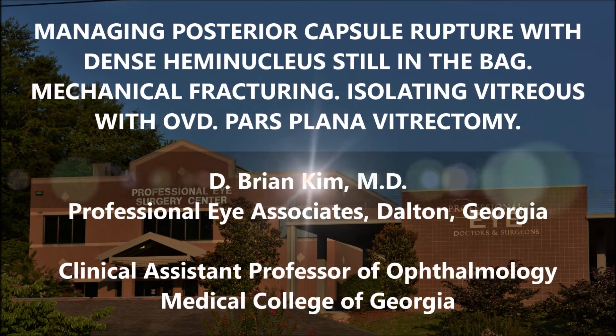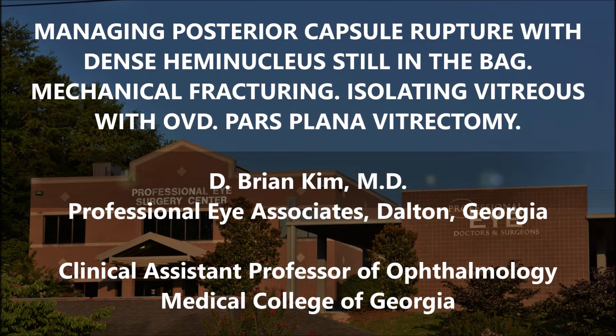This is Brian Kim. I want to share this case of a patient who has a dense white cataract. You're going to see half the lens still in and a rather large posterior capsule defect, and how I'm going to manage this. First, you have to have early recognition — you'll see the signs of how I'm able to identify this posterior capsule rupture rather early in the case, and then making the requisite steps of using viscoelastic to isolate the vitreous away from the remaining lens fragments.